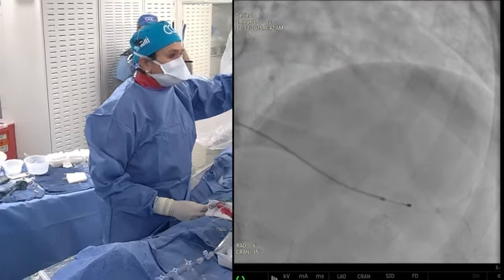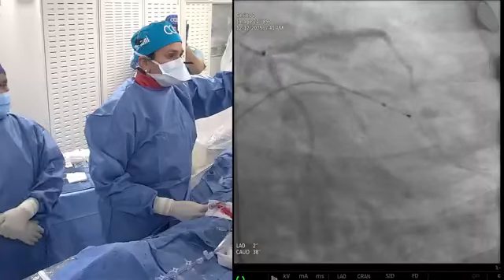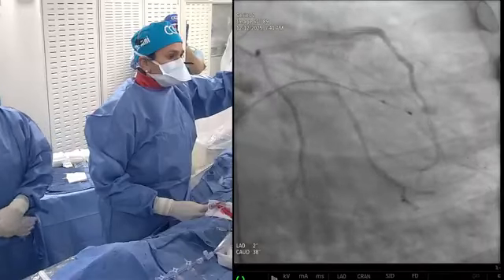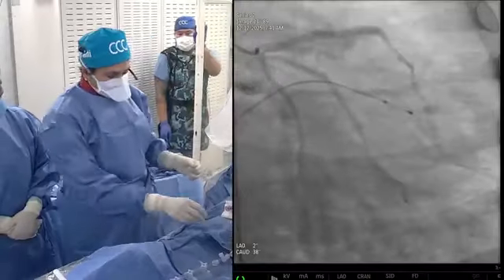Look at this. You need a better picture. But anyway, it looks all right. There is a diagonal disease left, circumflex is good. Let's go where the money is. Money is on the right side. We have the right picture.